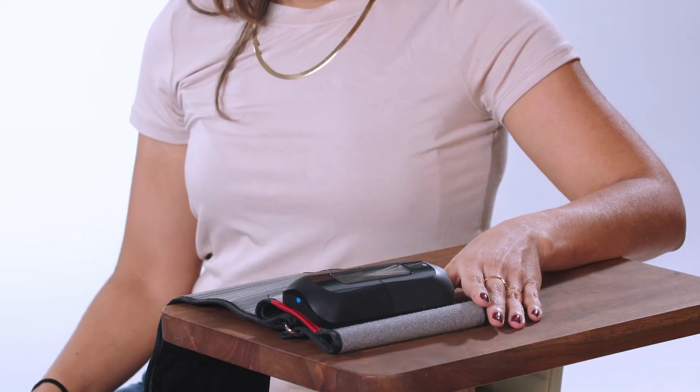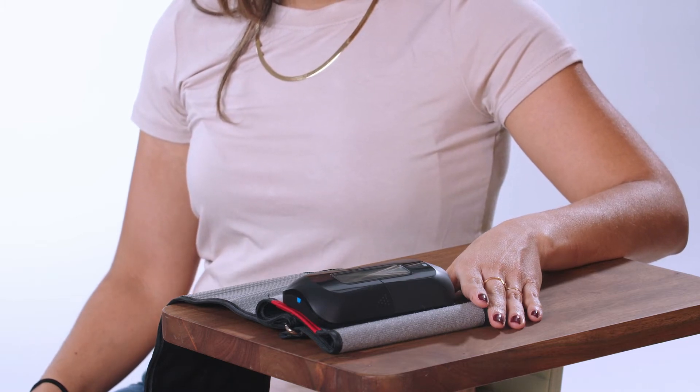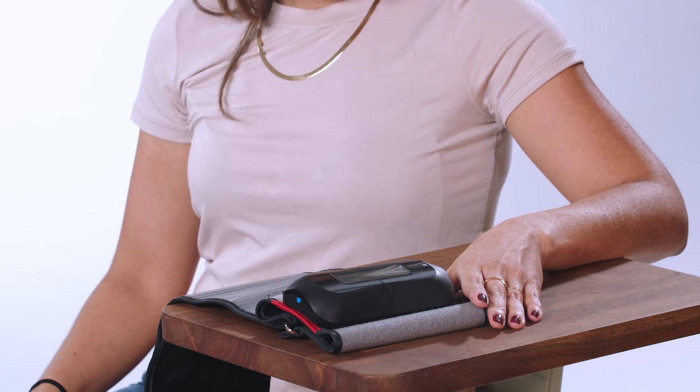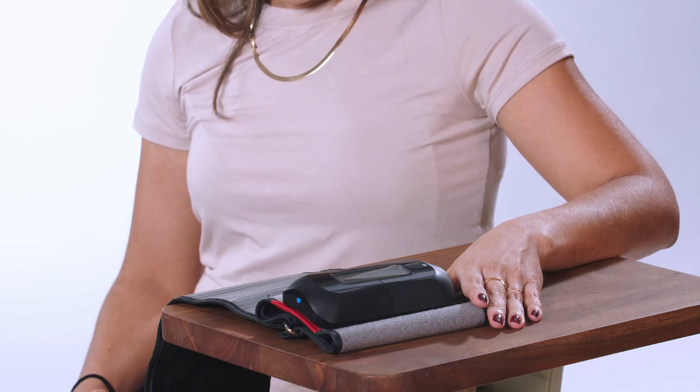Now let's take your first reading. Sit in a chair with a back for support, next to a table or other surface where you can rest your arm. Make sure your feet are flat on the ground, not crossed. Pick which arm you will use, and follow your physician's instructions if he or she told you to take your blood pressure on one specific arm only.